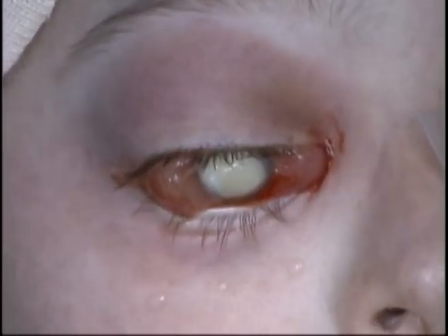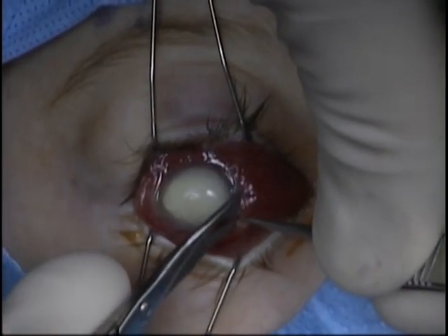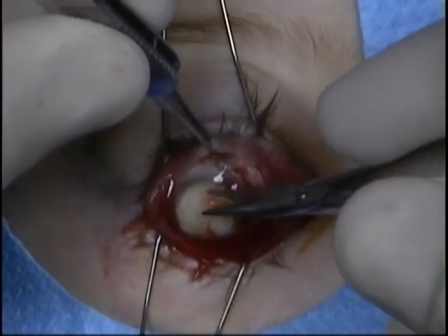The Westcott scissors are used to perform a 360-degree peritomy. There is often a bit of oozing, which in general can be ignored as it will stop.